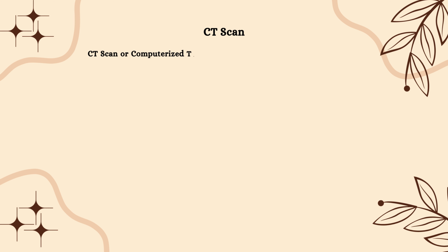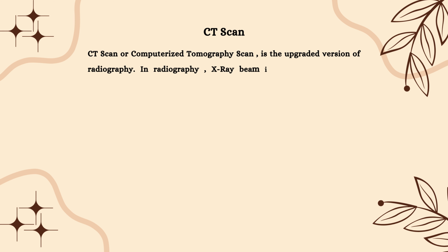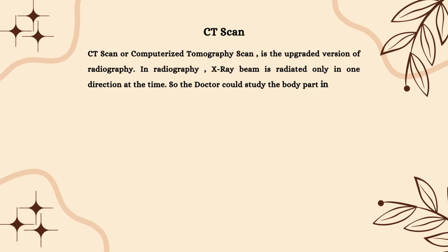CT scan, or computerized tomography scan, is the upgraded version of radiography. In radiography, the X-ray beam is radiated in only one direction at a time, so the doctor could study the body part in a 2D view and from some limited angles.